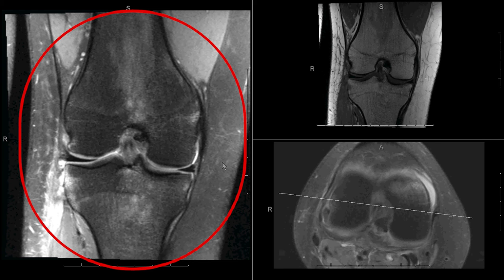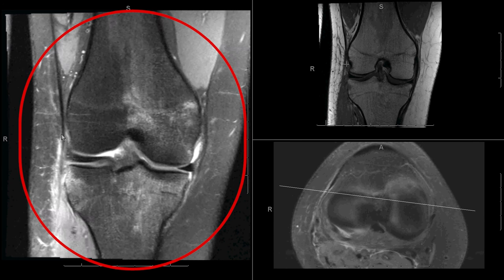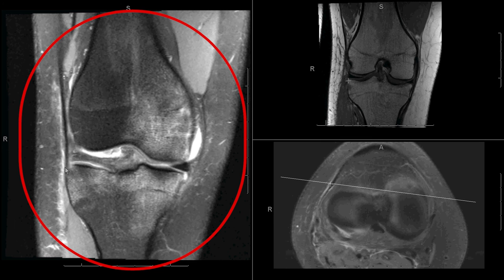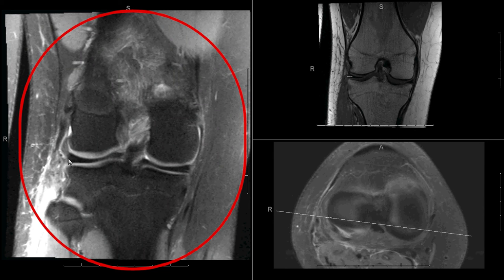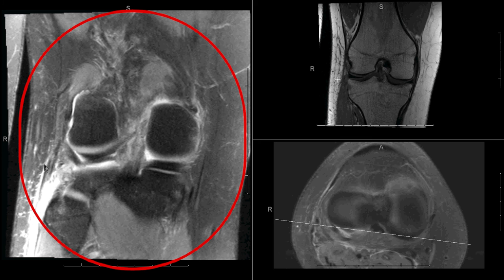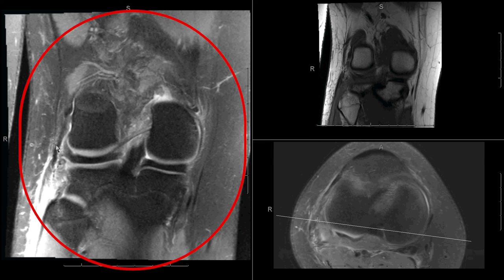Here is a patient with an intact medial collateral ligament, but who has a lateral collateral ligament tear. So let's see what is torn. First, the iliotibial band looks pretty good all the way along. And then we look at the biceps femoris tendon and the region of the fibular collateral ligament.